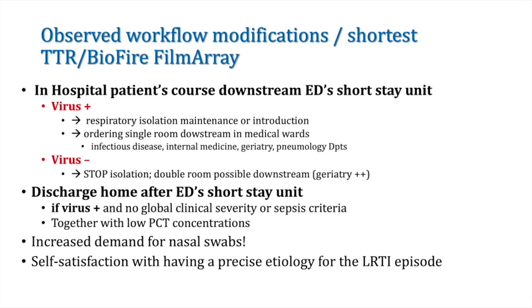So if we look at the observed workflow modifications introduced by the shorter time to result we get with the BioFire FilmArray. Concerning the in-hospital patient course, downstream of the emergency department short stay unit, for the patients for whom we had the confirmation of a virus, we maintained respiratory isolation, or we introduced isolation in case it was not in place before.